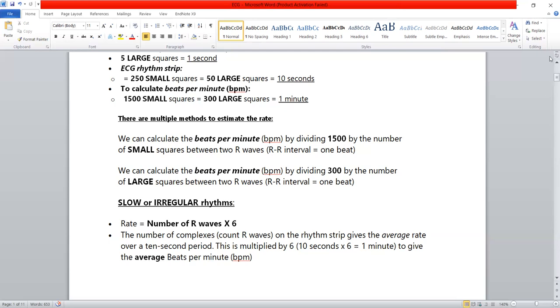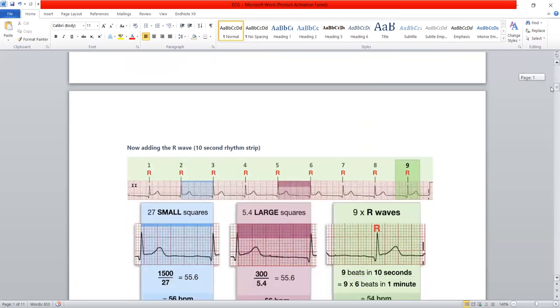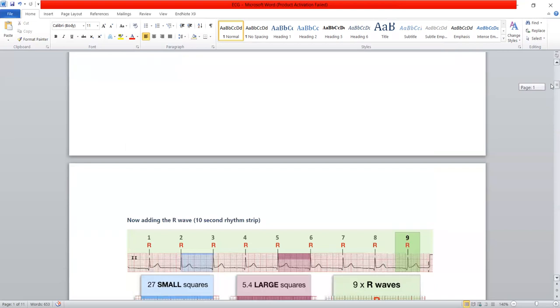Let's do some examples. Look at this ECG and calculate the heart rate. We need to count the large squares between two R waves. One R wave is here, another R wave is here. Counting the large squares between them: one, two, three, four, five — almost five large squares. So 300 divided by 5 is approximately 60 beats per minute.